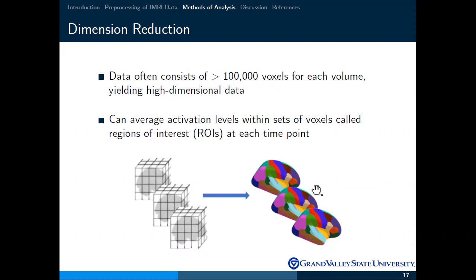These were developed by research teams by using a large number of scans across many people to see, okay, here's where the parietal lobe tends to be by looking at structural MRIs. Here's where the amygdala tends to be. And so they delineate the images by looking at a large number of participants' data that they've collected.